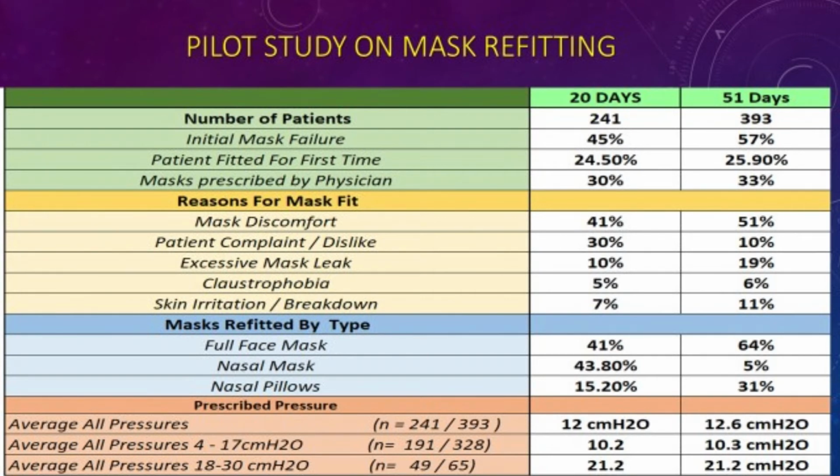So we were looking at why we had so many patients coming in to get a new mask. So we conducted a study for 20 days, and then we decided to continue it to 51 days, which was about 10 weeks.